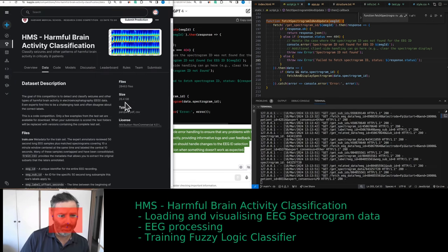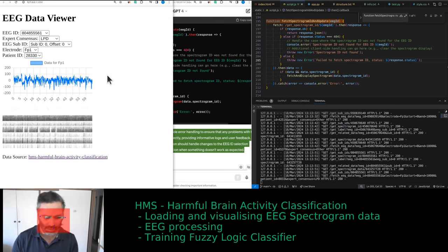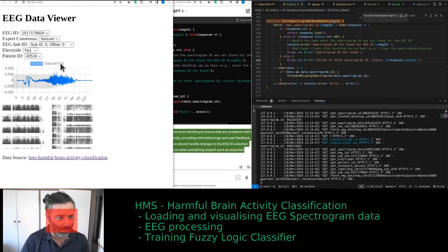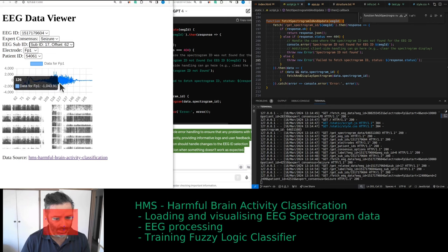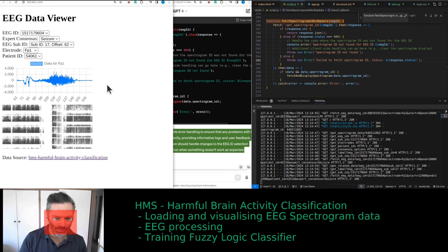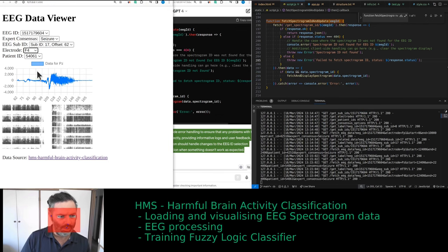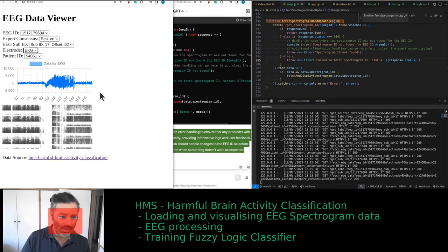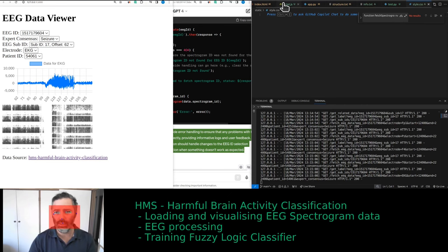We have the 26.5 gigabyte dataset downloaded on our server — it's an open access dataset. By default when loading the page, it loads this particular EEG ID, because it has something that looks like a seizure. You can check how it looks on different EEG channels, and check the ECG as well.